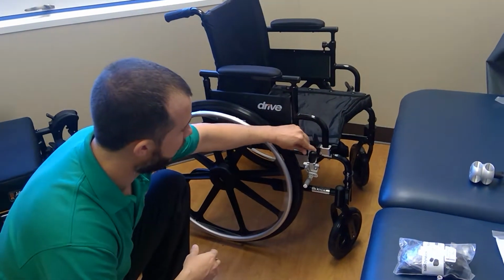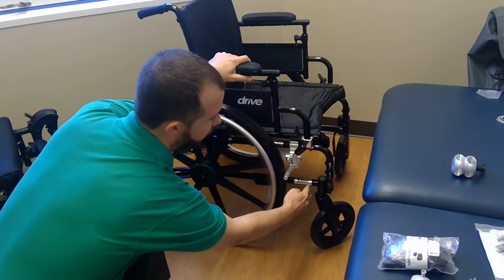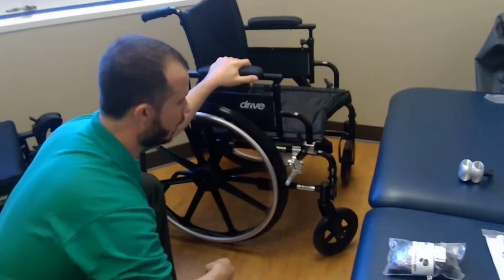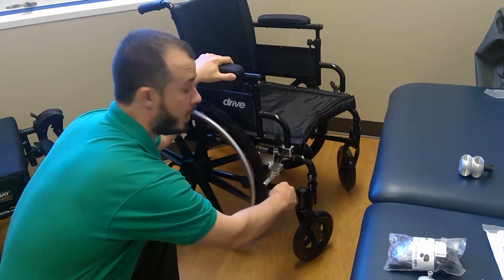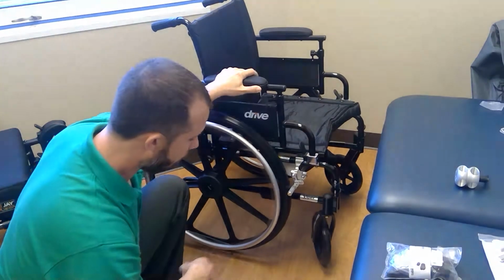So we want to look and see brake levers. How far out do they close? As we're building this mounting system up and over, we want to make sure that this brake lever is not interfering with the mounting system. If we had footrests on here and that client's going to be swinging and opening those footrests, are we going to be blocking any of that with the mounting system? So these are all things to think about.